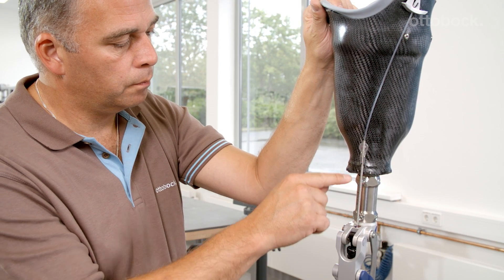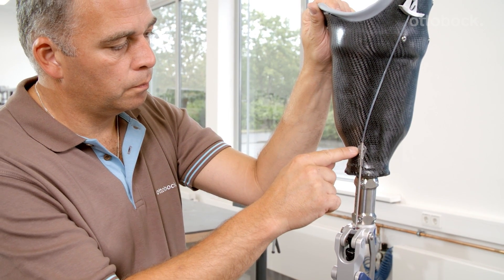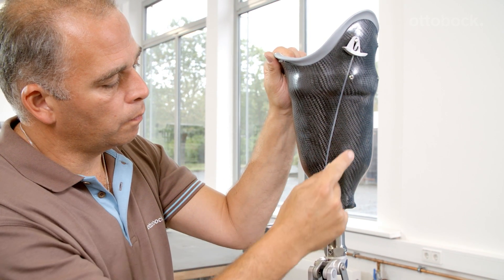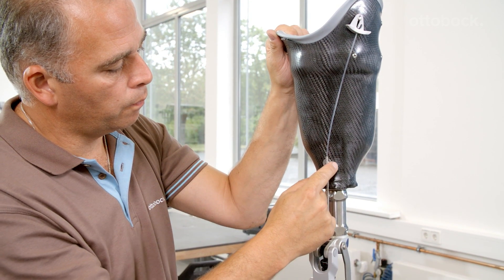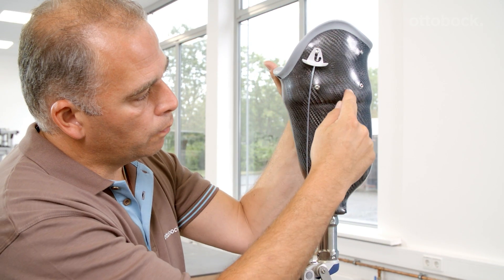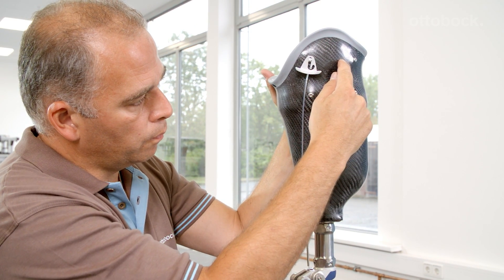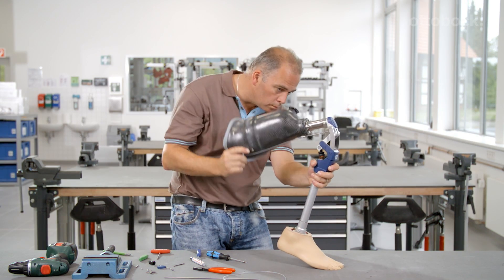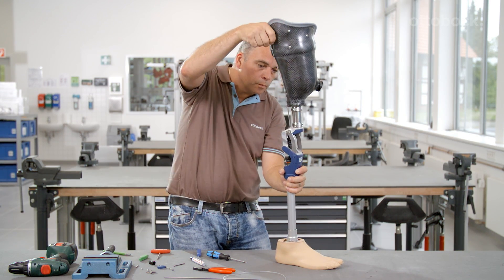Please observe all instructions for installing the lock release cable correctly. Finally, please check that the lock mechanism functions reliably.